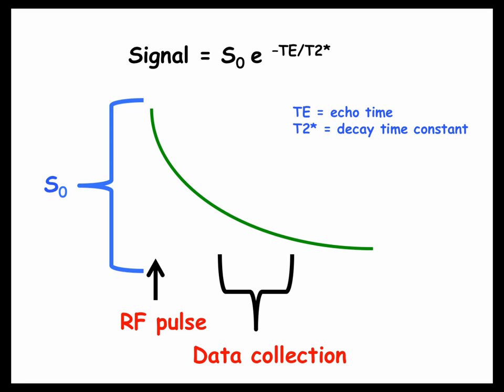So first of all, you're limited by spatial resolution in echoplanar imaging. In the imaging technique itself, you're limited by the T2 star decay. As I mentioned, there's only so much time you have to collect your data. Your T2 star is typically about 60 milliseconds or 70 milliseconds at best. So you only have that much time.